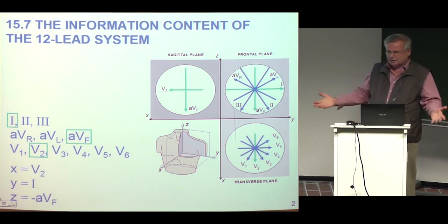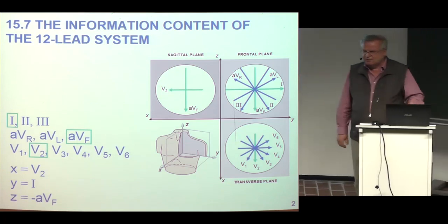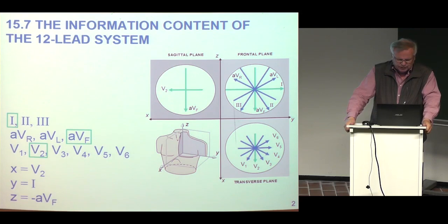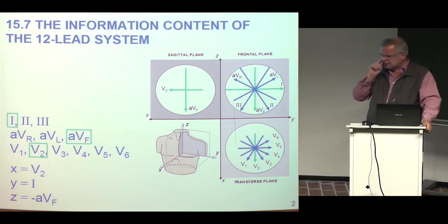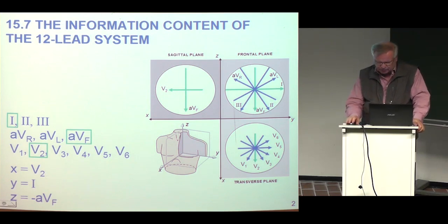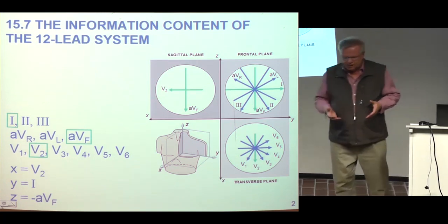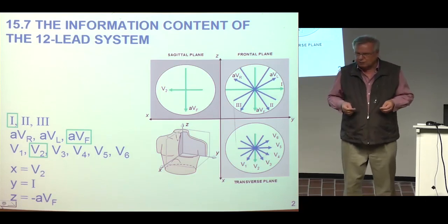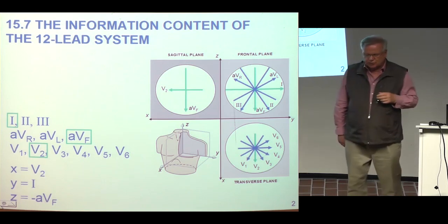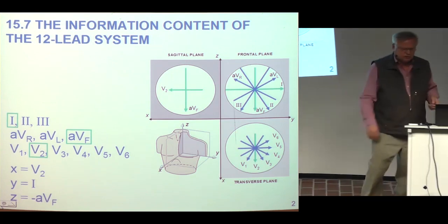As I said, if everything that has been done before would be forgotten and we should start from zero, then it could be designed in a different way. Why are all those 12 leads still recorded? The historical reason is very much that having all these projections in the frontal plane, all those six signals, helped in manual diagnosis, which is not done anymore. I think the new cardiologist generation cannot do manual diagnosis anymore. But some years ago, it was helpful for the cardiologist to see the different projections of the recordings to find out more easily the orientation of the cardiac dipole. So it is just a practical issue.